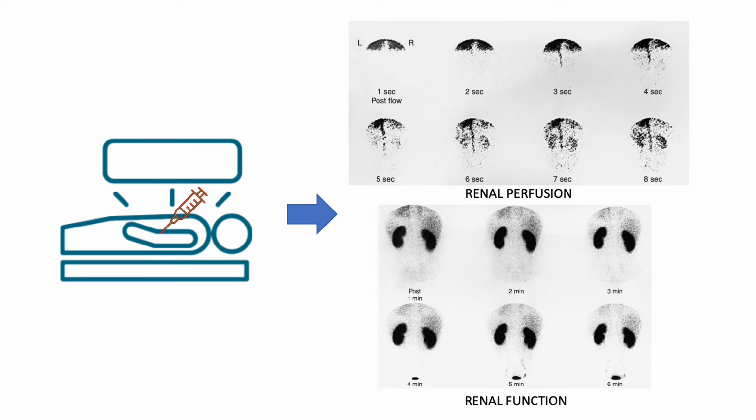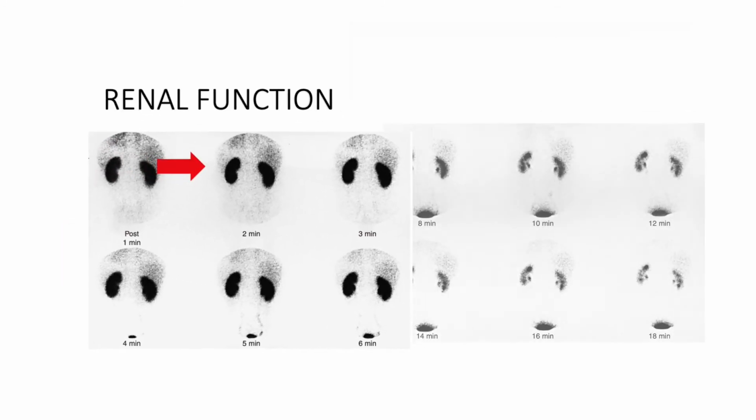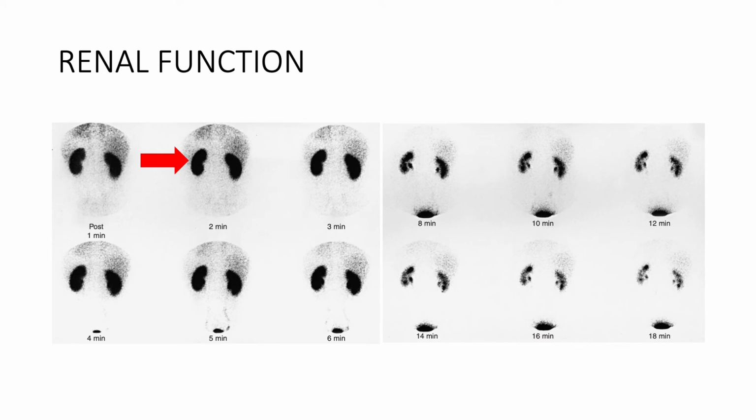At the end of the renal perfusion sequence, imaging for renal function begins. During the initial cortical or nephrogram phase, the kidney accumulates activity for the first 1 to 3 minutes, and the collecting system is either not seen or slightly photopenic. Peak overall activity should normally occur by 4 to 6 minutes. The kidneys should be symmetric in size.